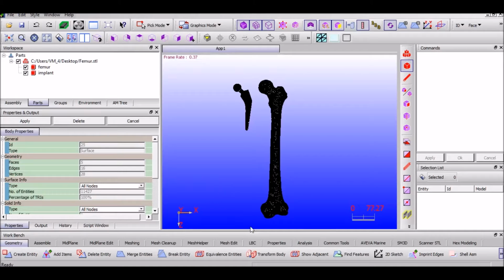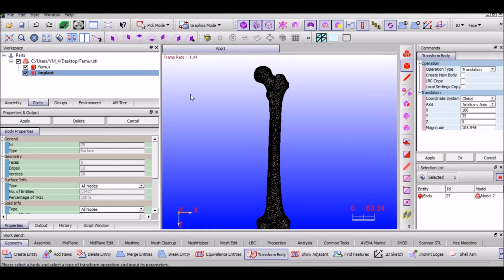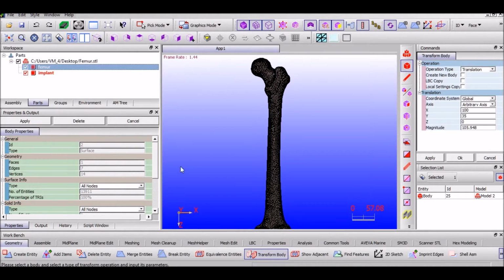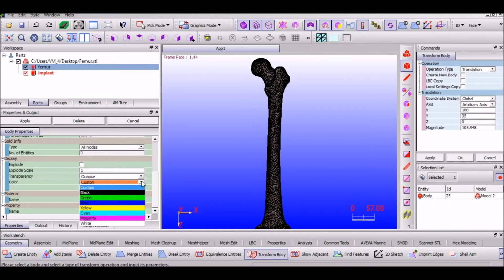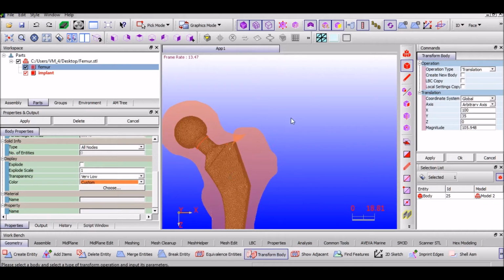Hence, select transform body, select translation, set the value of X as 100 and Y as 35. Select the implant body and click apply. By changing the transparency of the femur, you can see that the body has been implanted inside the femur.